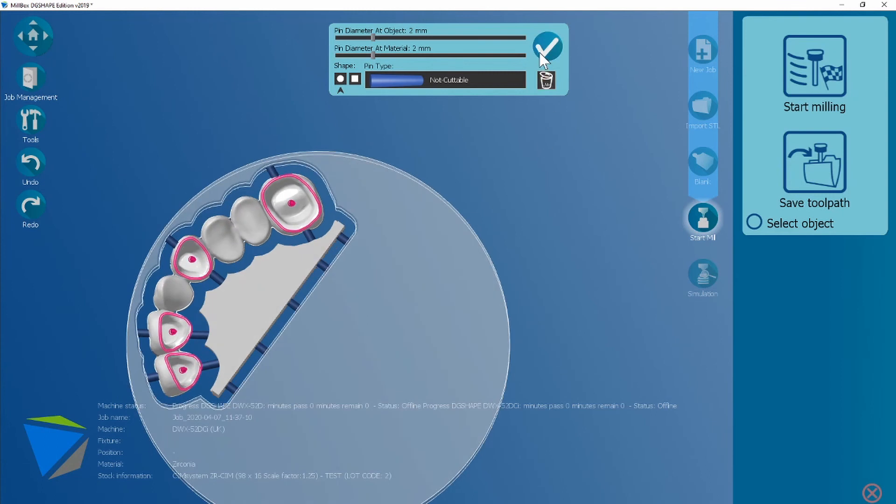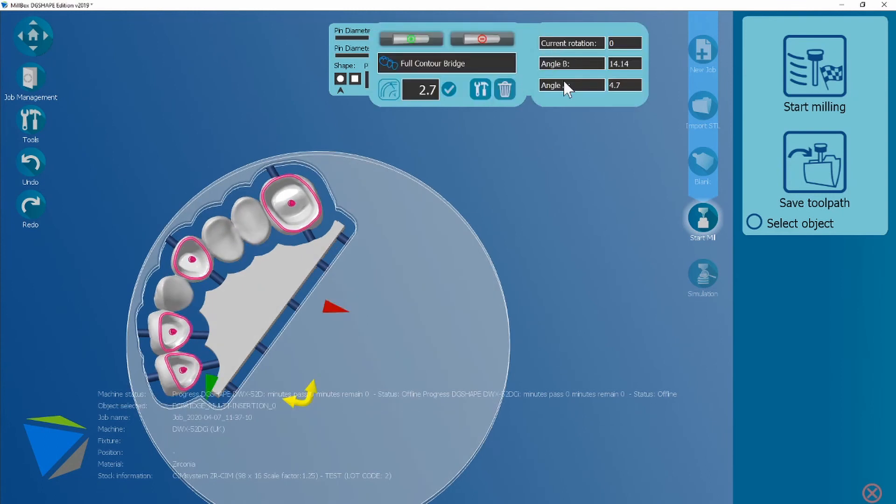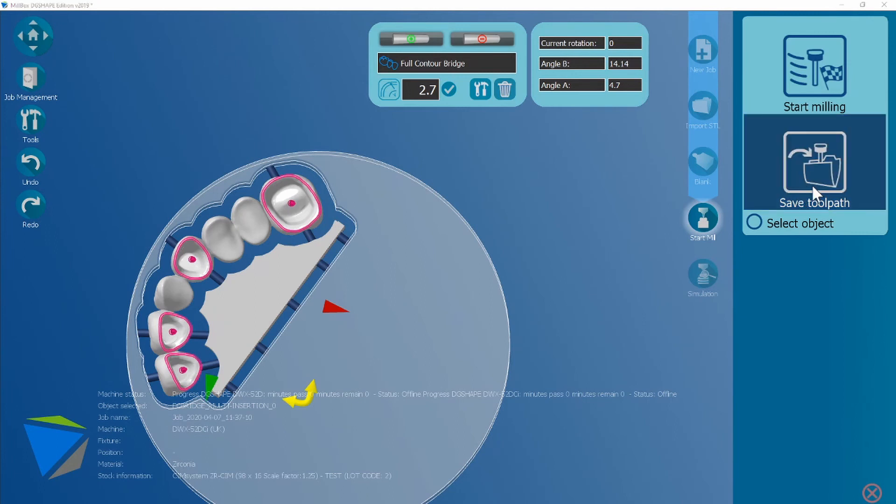Once you're happy, you're then going to go over to save toolpath like you did on the crown workflow. We're going to choose B this time.